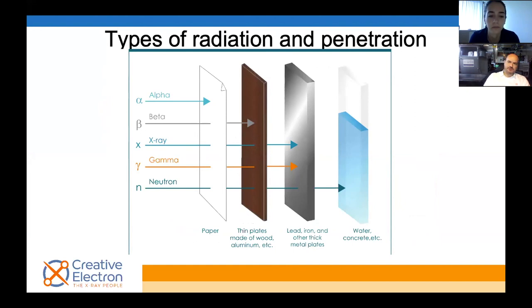But are people exposed to lead on the machine? No, the way from the manufacturing process, you sandwich the lead in between sheet metal, so you're exposed to the powder coat of the sheet metal, and then the lead is just built in. You can't really see it, but it's there to protect you.